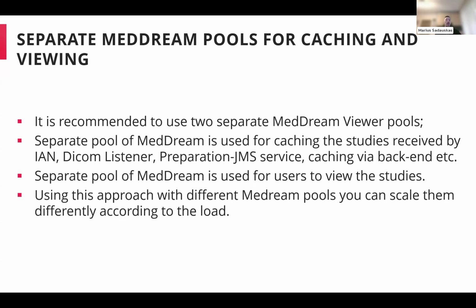Using this approach with different MedDream pools gives you, I would say, more flexibility, because you can scale them differently according to the load, and also the queues for the jobs and everything are separate. So this is also good even for a standard installation where you are not planning to scale the MedDream viewer. Also, this caching MedDream pool could be used for the temporary cleaning.